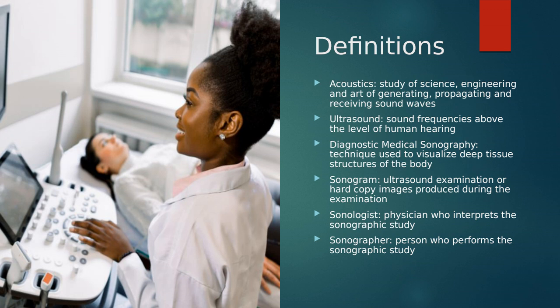Ultrasound, as we know, is the blanket term for sound frequencies above the level of human hearing. So anything over 20,000 hertz is something that we cannot hear. That's where we're going to fall into the ultrasound technical world. So anything above that 20,000 is where we're going to be operating. Diagnostic medical sonography is, again, another blanket term that we use to describe the technique of looking inside of the body and looking at structures that are internal.